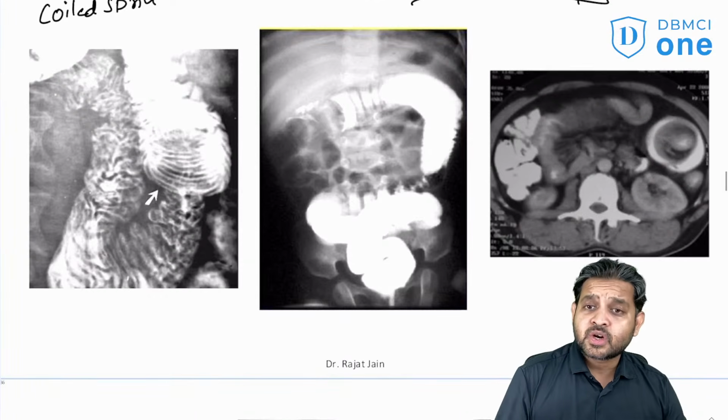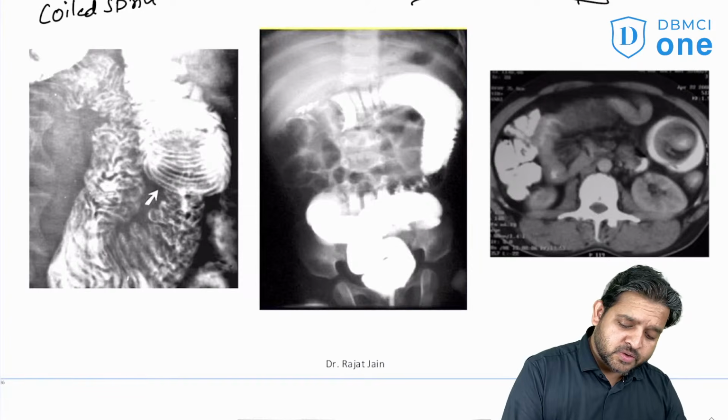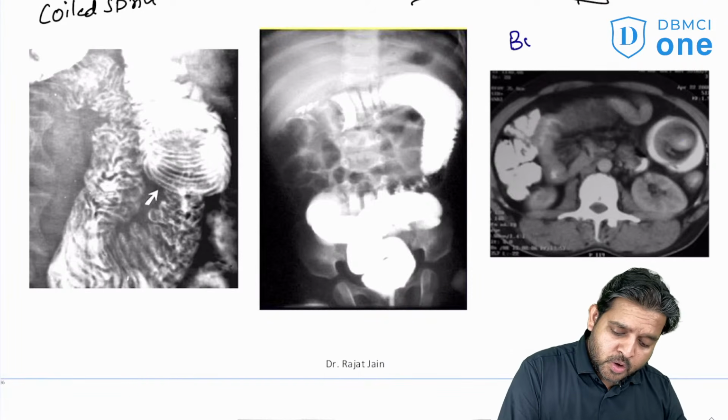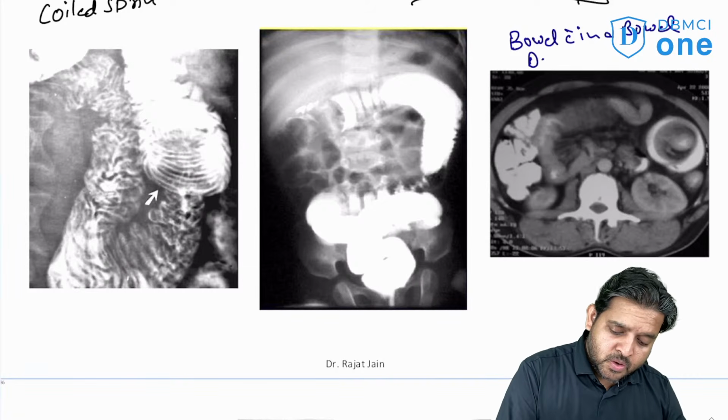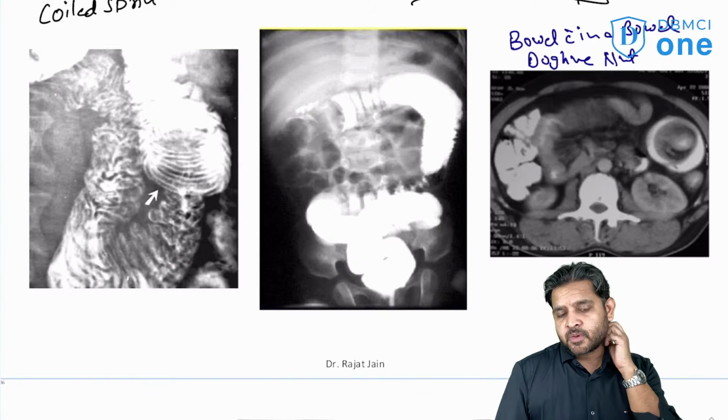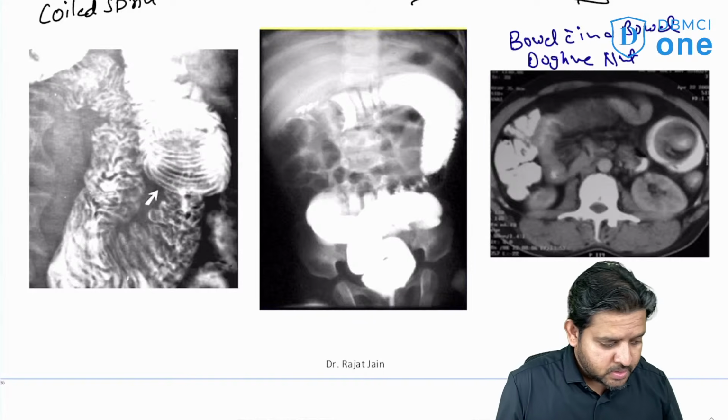Intussusception, right? So this is not a CT time, but on CT also you can see this as a bowel within a bowel appearance. Bowel within a bowel appearance, also called donut appearance.